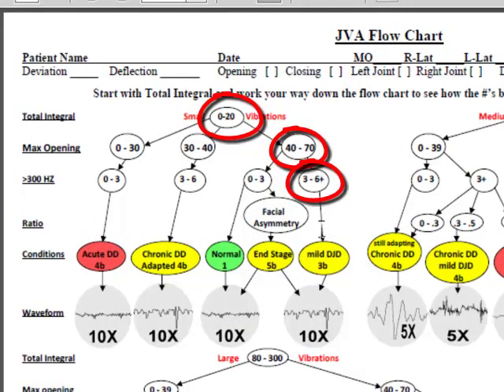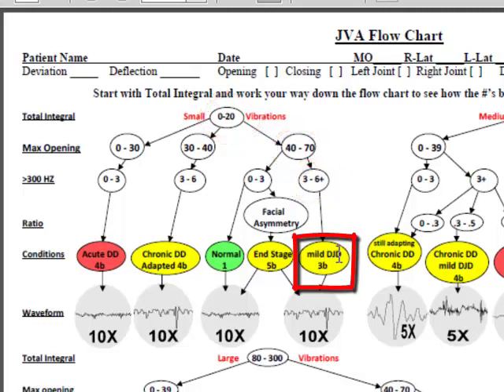We continue down and my right TMJ is consistent with mild DJD, which is degenerative joint disease, or 3B, which is the Mark Piper stage 3B of the TMJ. And that's how you interpret a JVA trace.